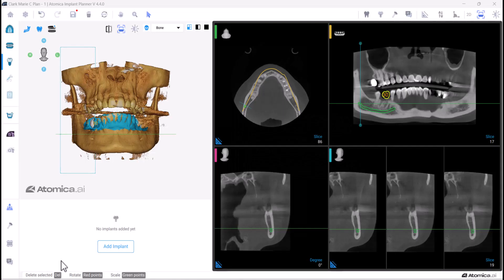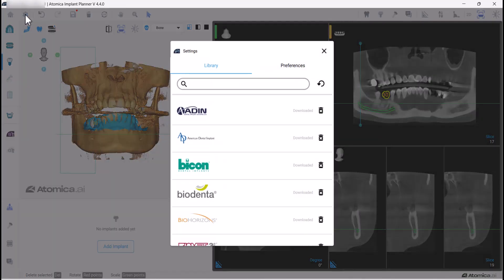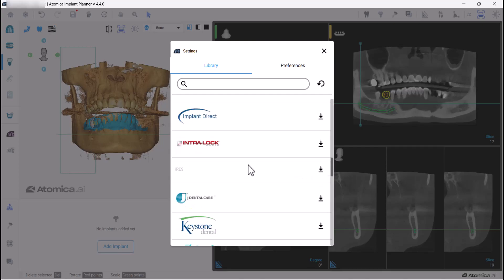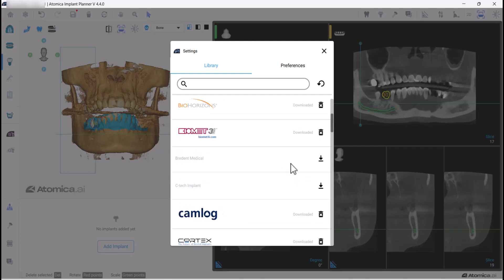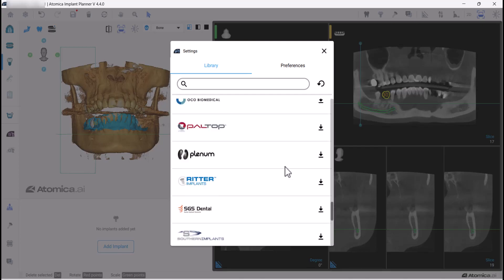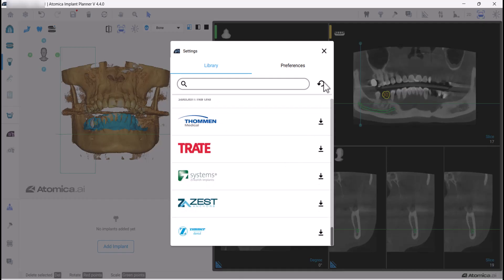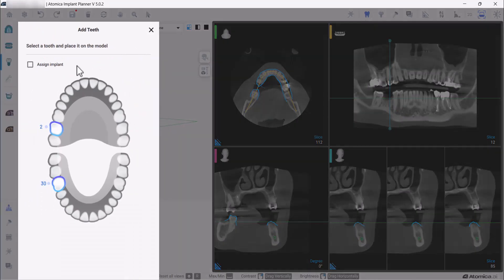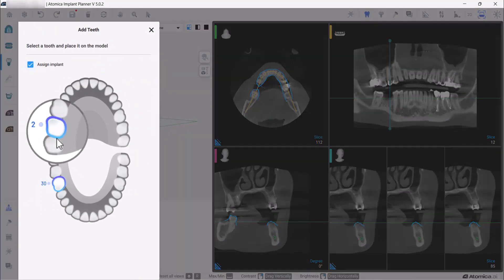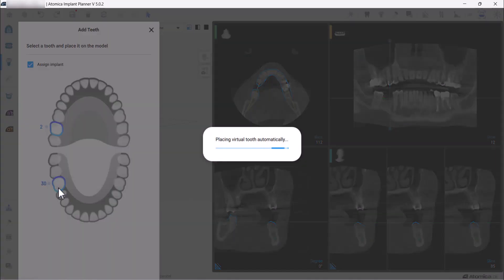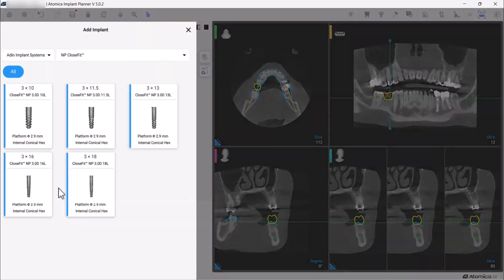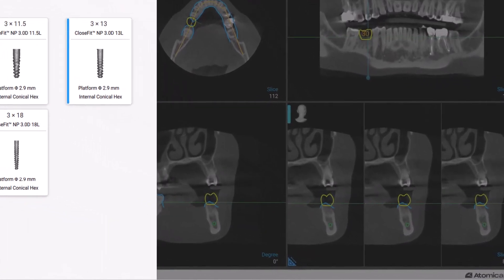Let's add our implant. First, go to Settings and download your preferred implant system from the implant library. Click on Add Tooth and mark Assign Implant. Select the tooth you will be working on.